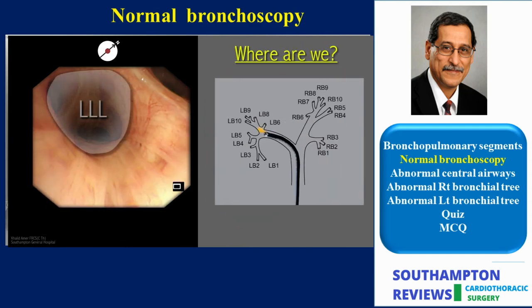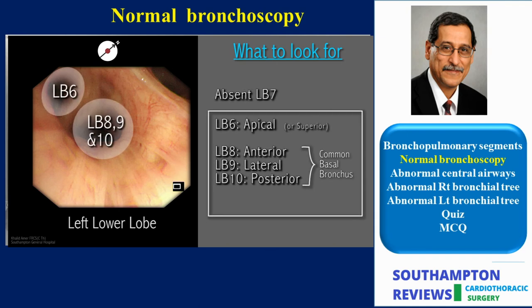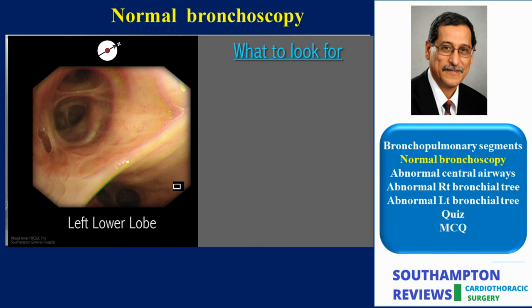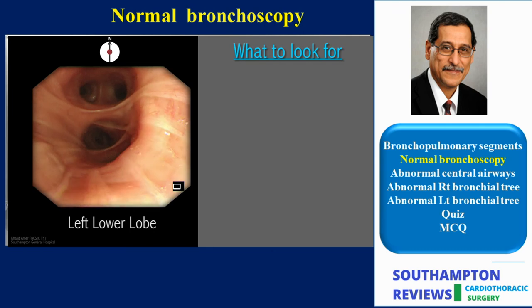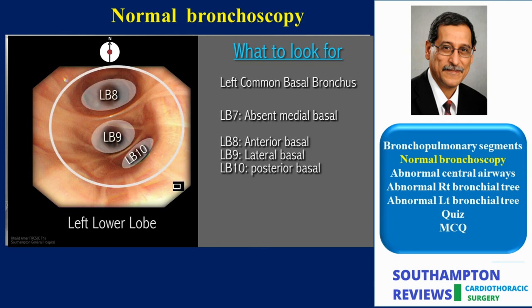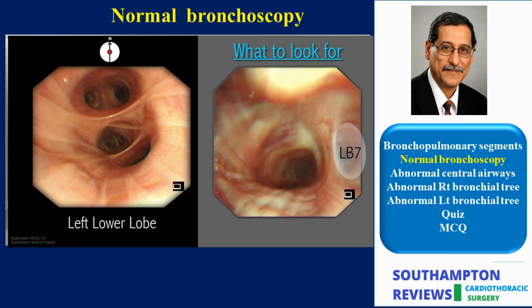The scope is then retracted before being introduced into the left lower lobe. Once more, note is made of the secondary and tertiary carinae to define the inlet and outlet of the lower lobe bronchus. The space from carina to carina is appreciated as that of the left lower lobe bronchus. Like the right side, the left lower lobe retains the structure of an apical segment and common basal parts. The apical segment is known as Lb6 and usually divides into three subsegmental bronchi. We now know that the medial segment or Lb7 is squashed and usually missing in the normal arrangement; therefore one would expect to see three divisions: the anterior Lb8, lateral Lb9, and the posterior or Lb10. The commonest variation to the common basal segments is two divisions, and sometimes the medial basal Lb7 persists.